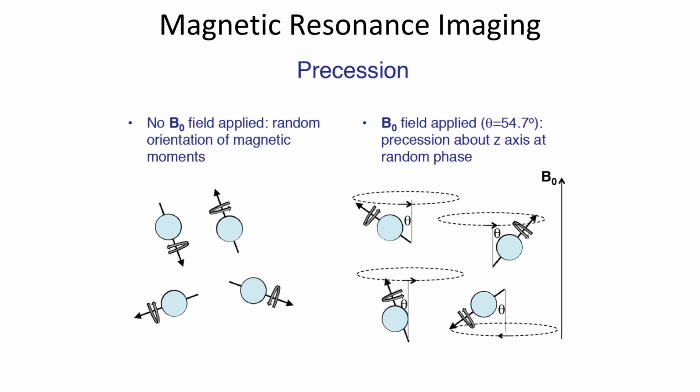The next image is just showing how these protons are randomly aligned without a magnetic field, and then once you introduce a magnetic field, they begin to align either in a parallel or anti-parallel direction. And obviously, the stronger the field, the more in alignment they will be. We have a weak magnetic field in the Earth, which is not significant enough to align these in a meaningful way that we can extract a signal from them.